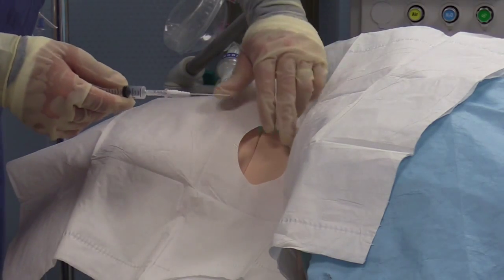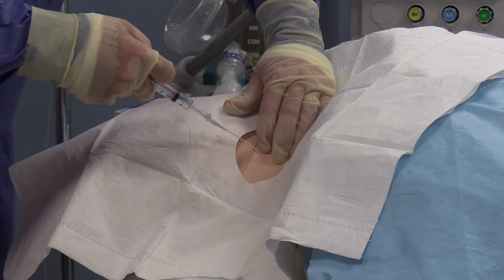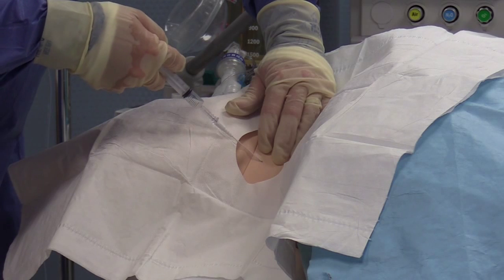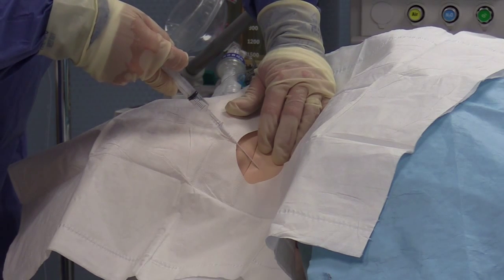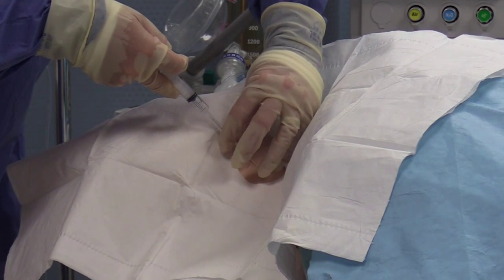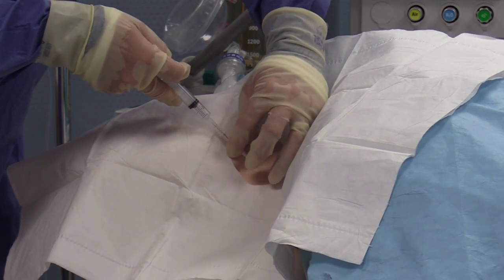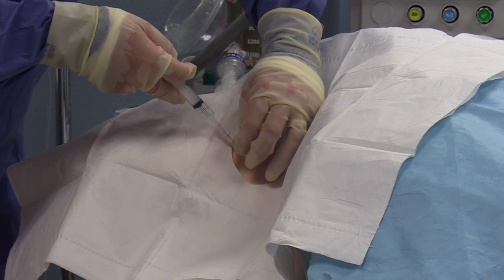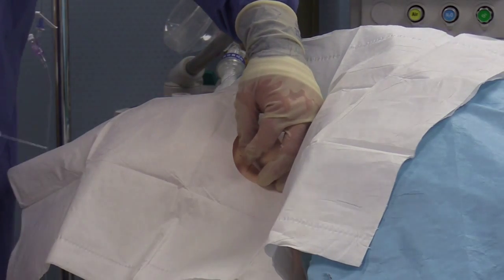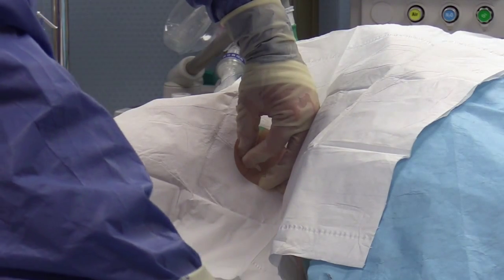You would insert the finder needle connected to a 5 or 10 cc syringe at a 45-degree angle toward the ipsilateral nipple line. While inserting the needle, continue to aspirate on the syringe until a steady, free flow of blood is observed in the syringe. Slide or gently twist the catheter flush with the skin line into the neck and remove the needle and syringe. After the needle and the syringe are removed, place the thumb over the cannula hub to prevent bleeding.